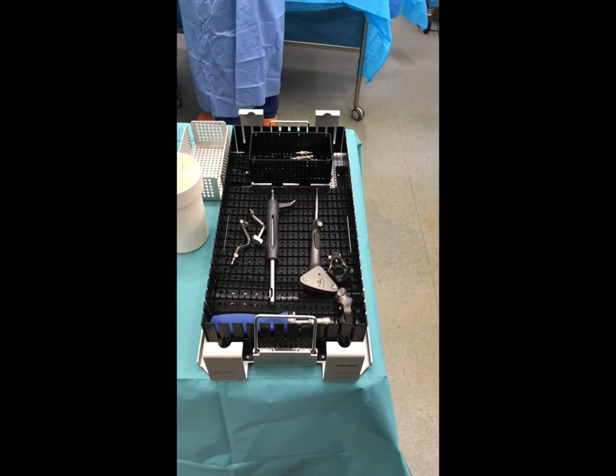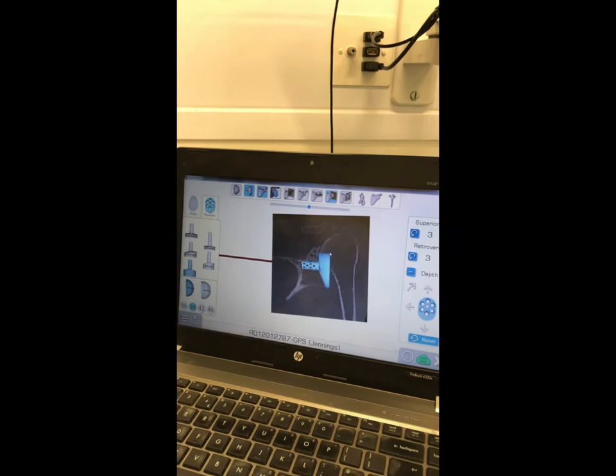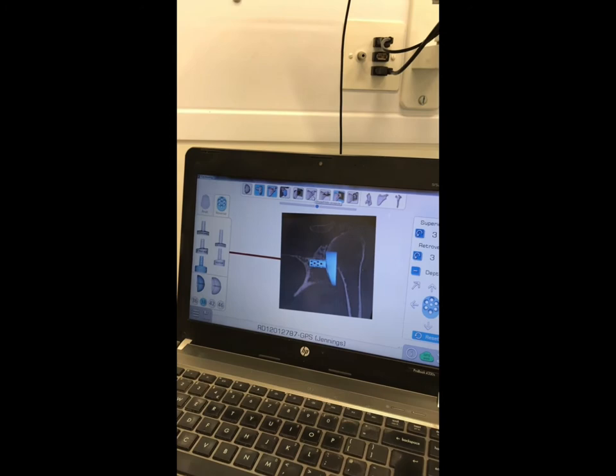You can see we plan for a superior augment. This corrects the angulation, and it also allows us to preserve bone. And we figured that with a standard base plate, we'd need to remove at least 4 millimeters of inferior bone to get decent contact with the back of the base plate.